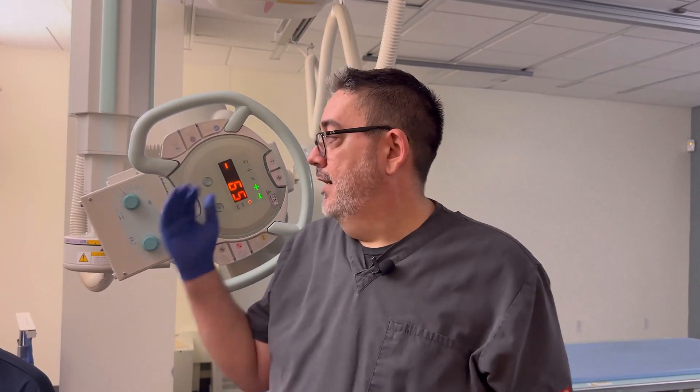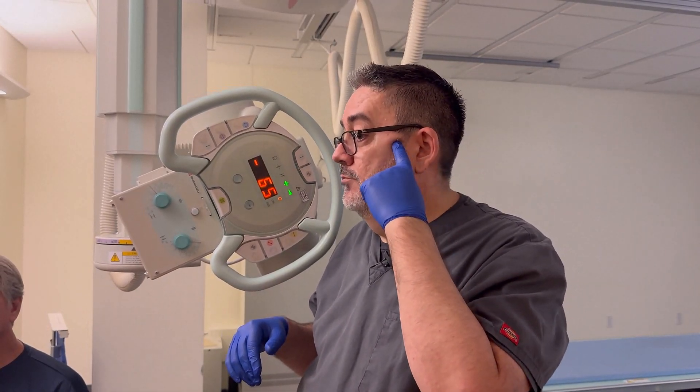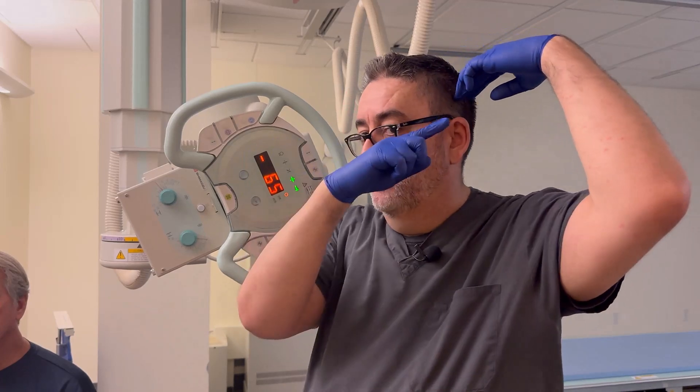We're going to start with the patient in a true lateral position with the IOML parallel to the floor, and then angle the tube 25 degrees caudal. The central ray is one half inch anterior to the upside EAM and two and a half inches superior. The half inch anterior is because that's where the TMJ is, so you're centering over the TMJ with an angle, but two and a half inches superior so that it's projected through the downside TMJ.